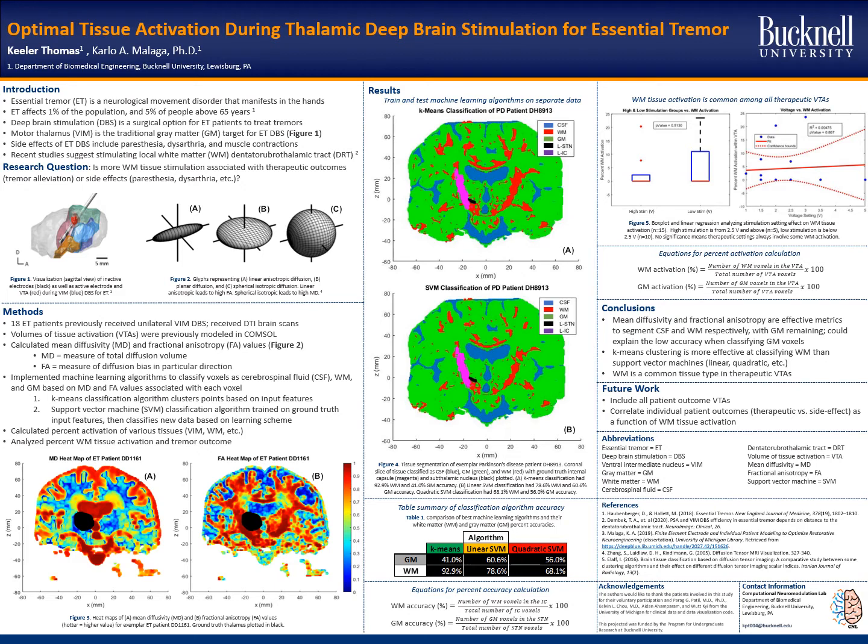In further analysis, I will include all patient outcomes and VTAs, not just therapeutic ones. Once these new patient outcomes are included, results of non-therapeutic statistical analysis can be interpreted in tandem with therapeutic results, showing any possible significant findings.